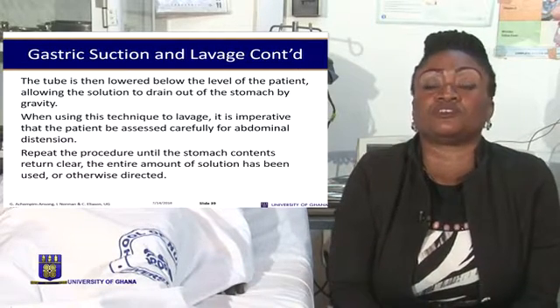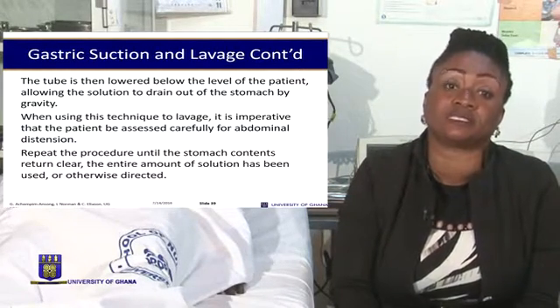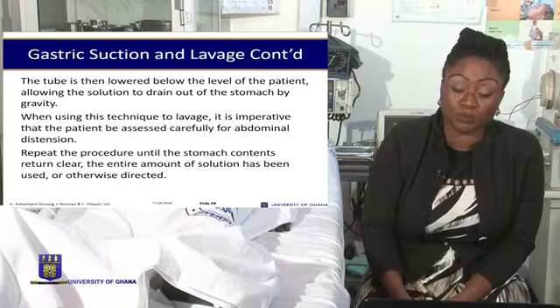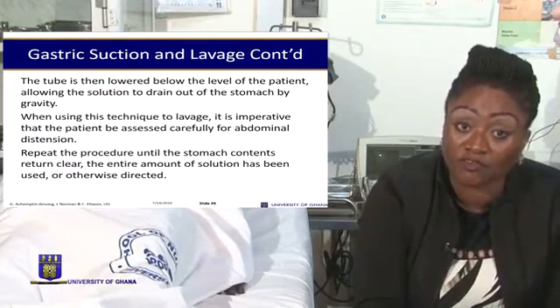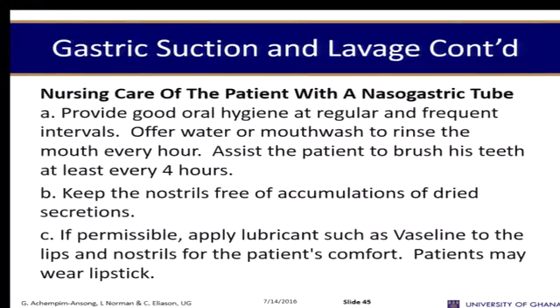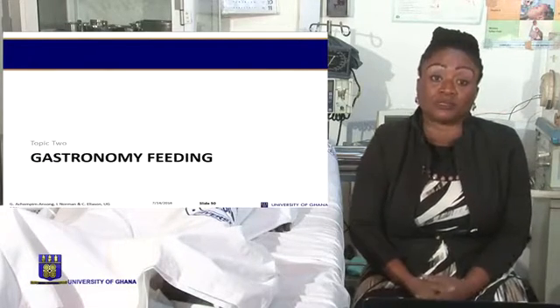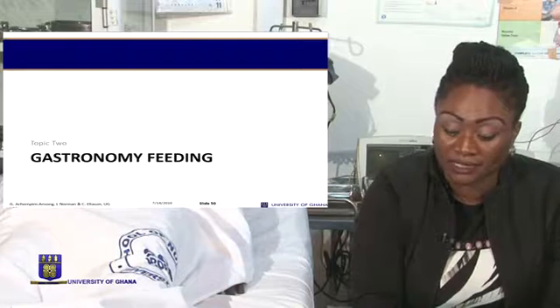The passage of the nasogastric tube is not comfortable, so the patient needs words of reassurance, and is asked to remain still and calm. When the tube is being passed, the patient is also instructed to keep swallowing so that it will be able to pass through the normal channel. The tube is tested for placement before introduction of the solution for the washout. After the procedure, the trolley is discarded, the patient is made comfortable, and then recording of the procedure is done in the nurse's notes and the report book as well. It should also be recorded in the intake and output chart.